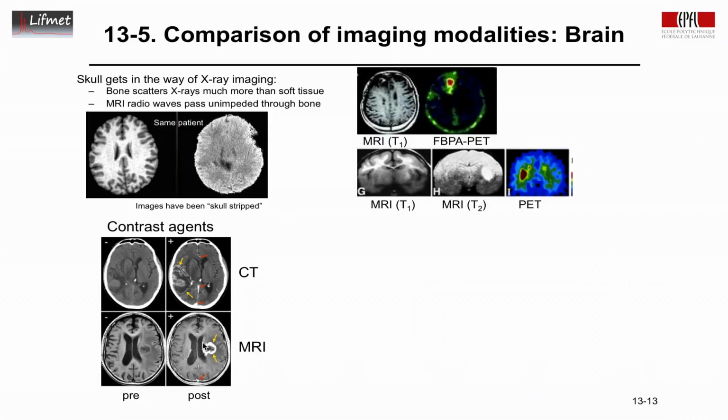Now here, in the MRI, the contrast agent tells us that at the periphery of this lesion, there's a lot of uptake of contrast agent. Contrast agents with MRI are typically limited to the blood. So if we see uptake into the tissue, it means that the blood-brain barrier has been ruptured. These are, of course, brain scans. And this is typically the zone where the aggressive cancerous cells are. The inside does not have much blood flow, so it's most likely a necrotic core.